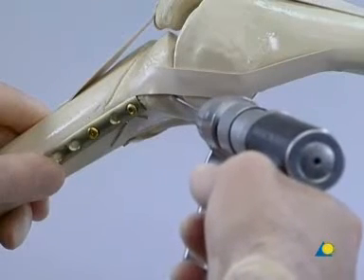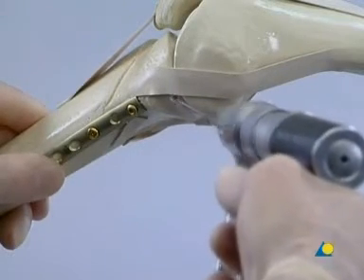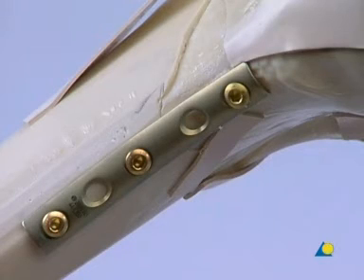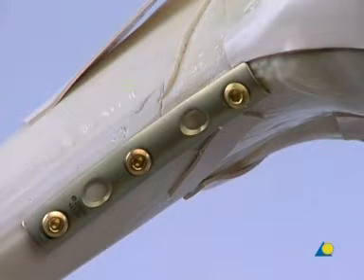After placing the most proximal screw, the first screw will need to be re-tightened. The K-wire must now be removed. The third cortex screw is inserted through the most distal plate hole. At this point, an intraoperative x-ray is advisable, as shown in this clinical example.